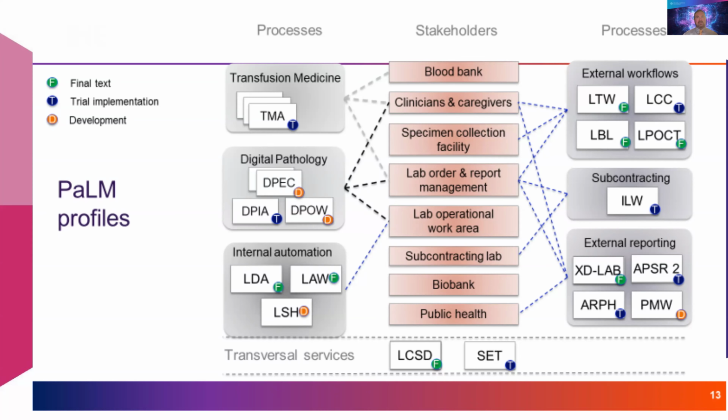It's not just about the image, it's about how do I pull data into an image? How do I map metadata into it? As we know, your scanner's not going to natively have all of the information about a particular slide. It needs to make a call to the LIS to say, hey, can you tell me the specimen type, the organ site, the stains, etc., patient information. So what IHE profiles tend to do is connect different pieces or components in your workflow and allow them to exchange information.